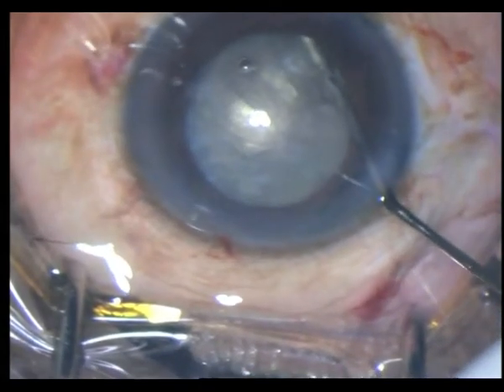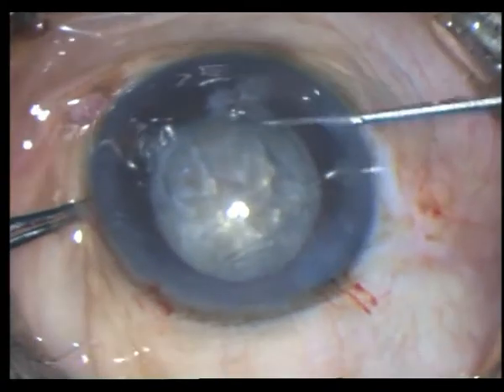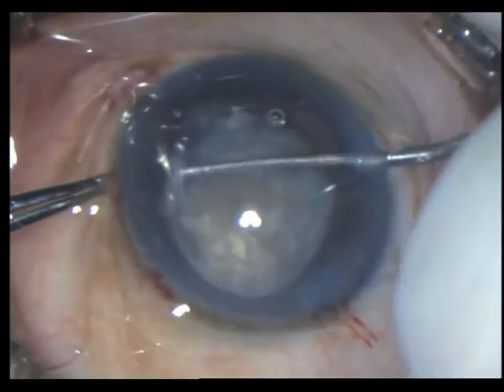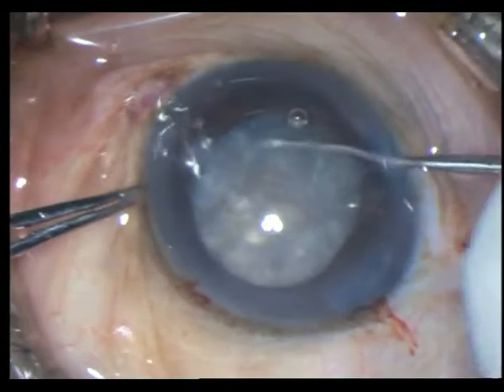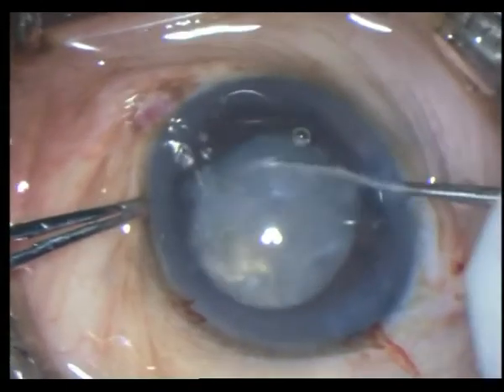Placing HPMC, I then use a Szynski hook to rotate the nucleus. This achieves a lot of things — it first of all makes sure that the nucleus is mobile, and next it kicks up all the loose cortex.